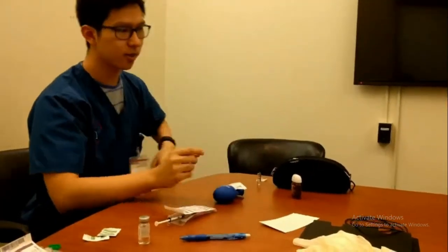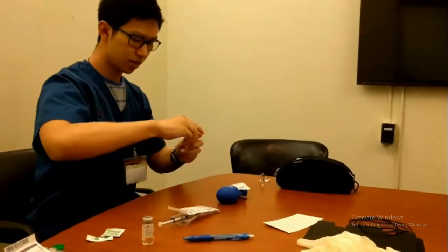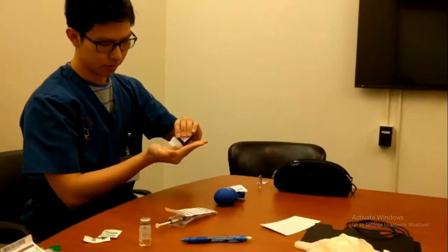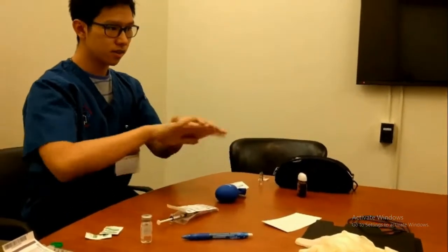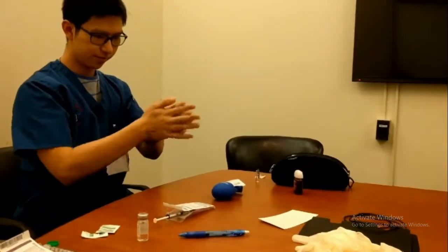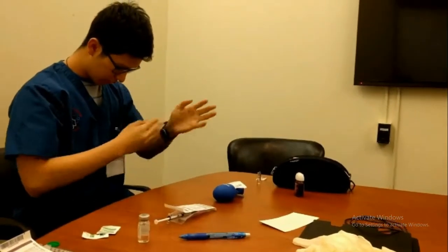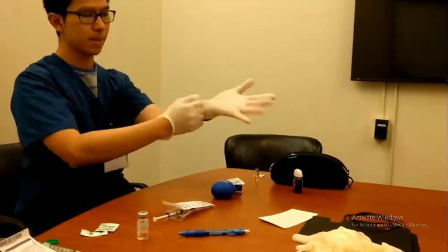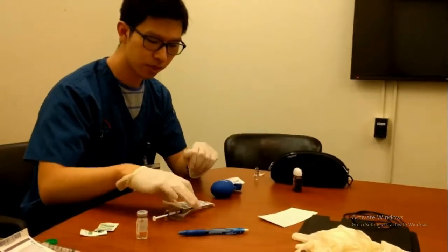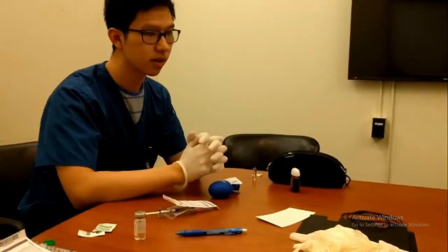Alright, so in order to start the actual injection, I will first be doing hand hygiene. Again, with real hand sanitizer in the clinical placements. Alright. And then I will be donning my gloves. And then I will walk into my patient's room with the needle.